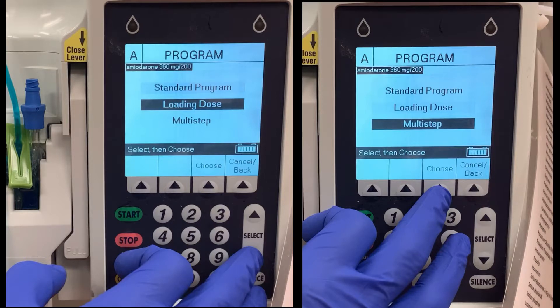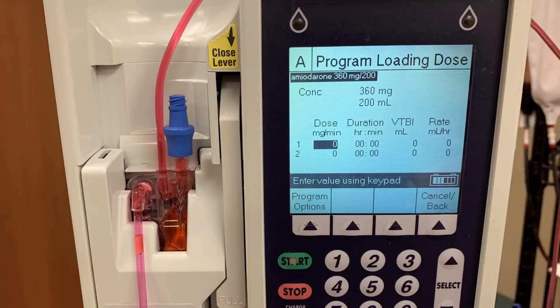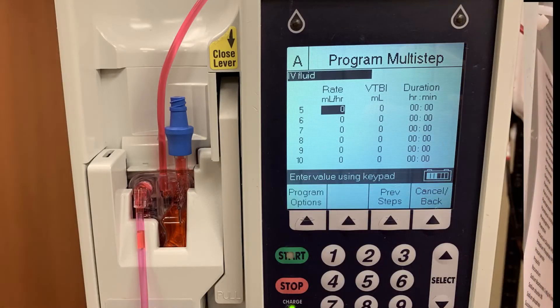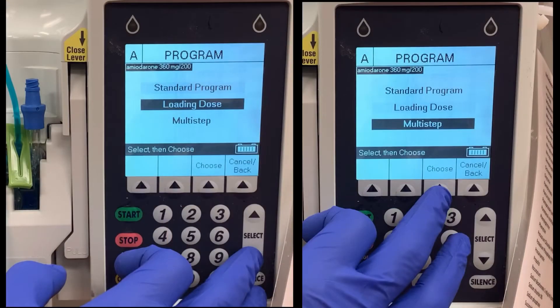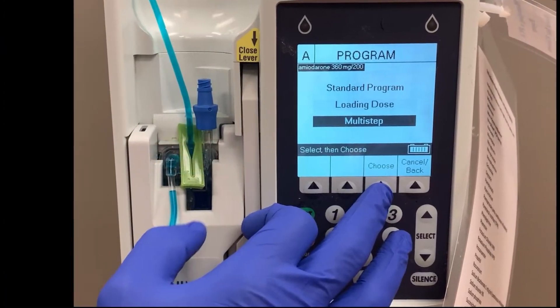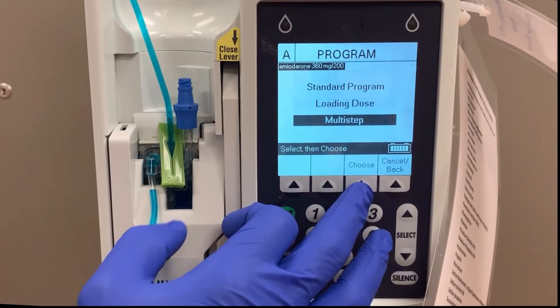Both have a similar function. Loading dose allows for two different infusion rates to be scheduled, while multi-step allows a provider to set up to 10 different rates. We will look at a multi-step program option for this example.